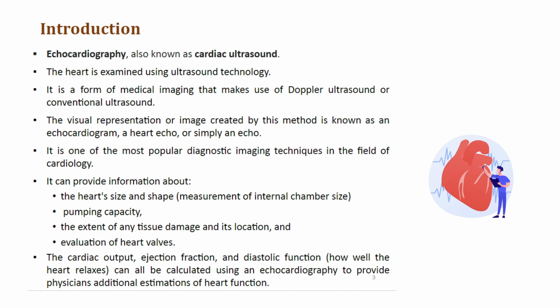The visual representation or image created by this method is known as an echocardiogram, a heart echo, or simply an echo. It is one of the most popular diagnostic imaging techniques in the field of cardiology.